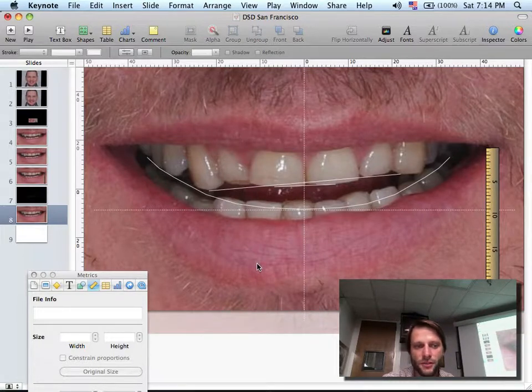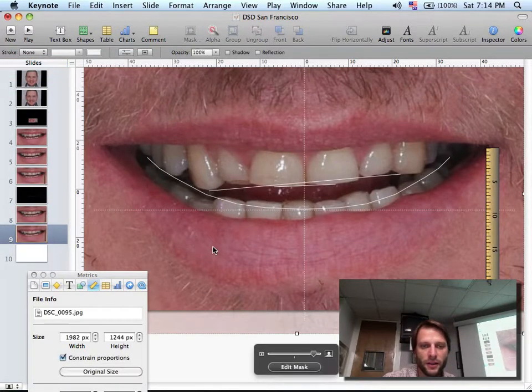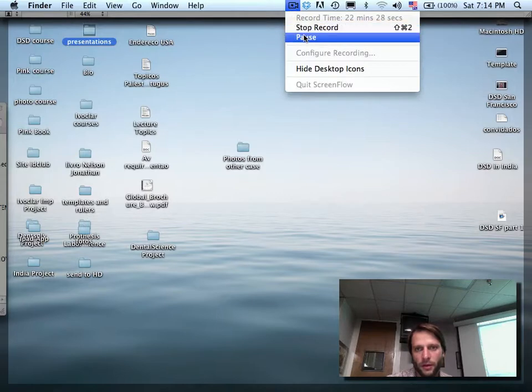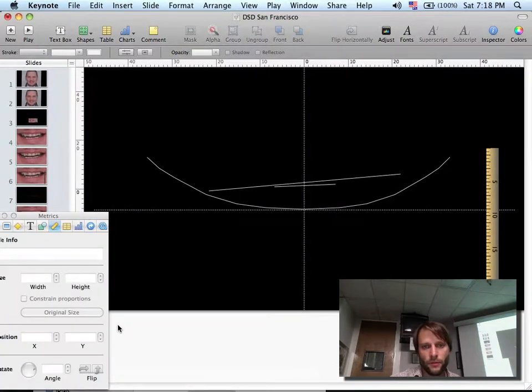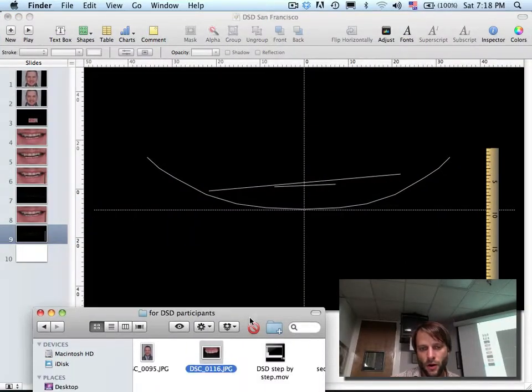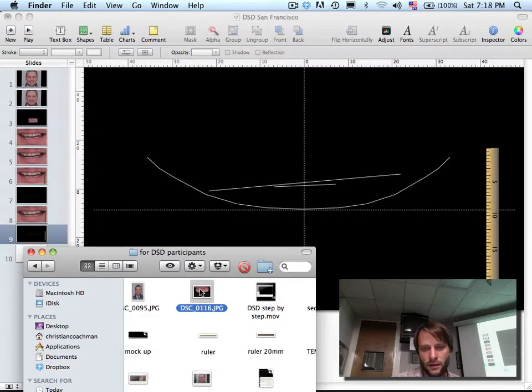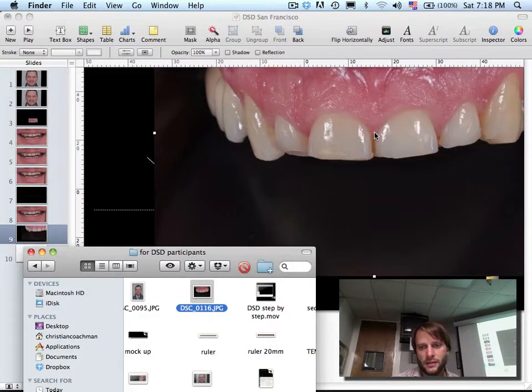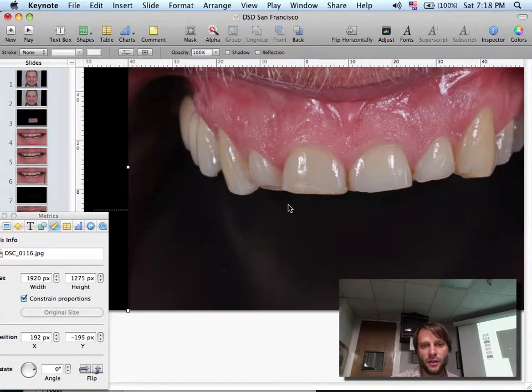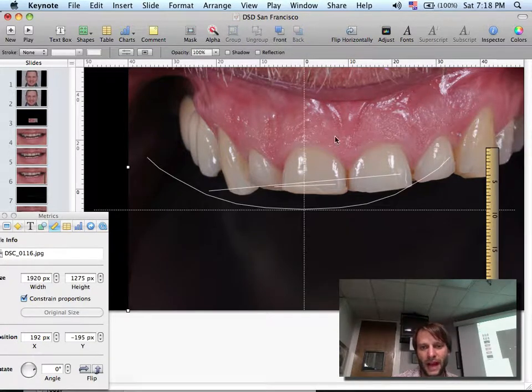Once you did these two lines, you can click on the picture and delete the picture, so you only have the lines. I'm going to save it and pause. So now I have to bring in the intraoral picture. I open the folder with the pictures of the patient, and I drag the intraoral picture into the slide, and it will come on top of everything else. I have to click on the picture and send it back. Click on the top there, back, so it's behind everything.